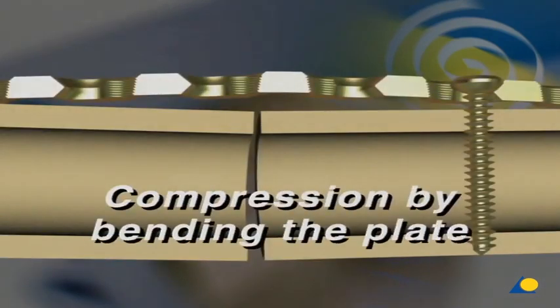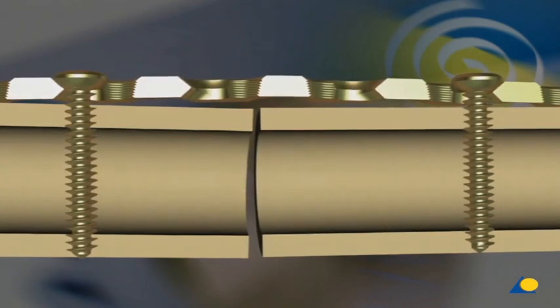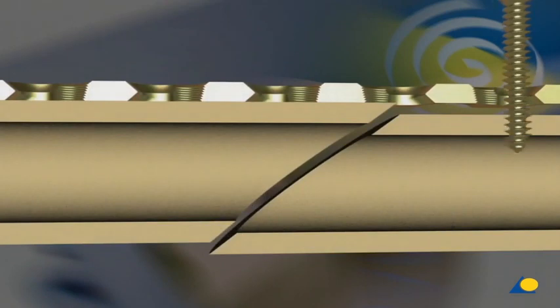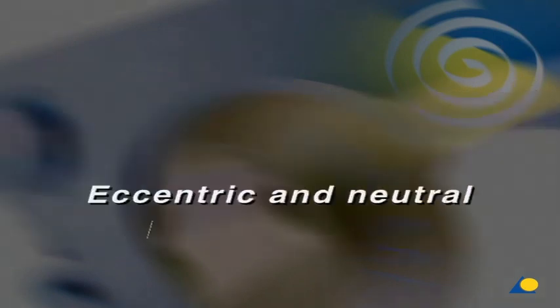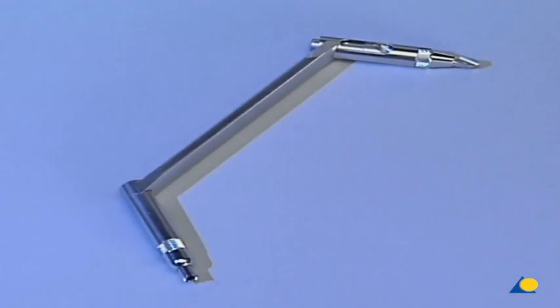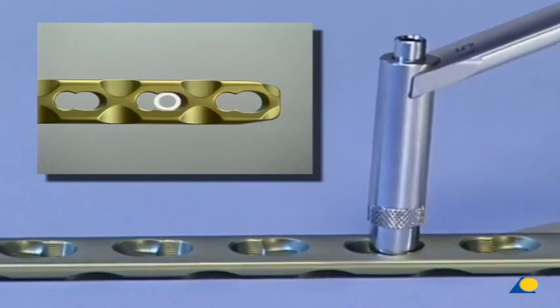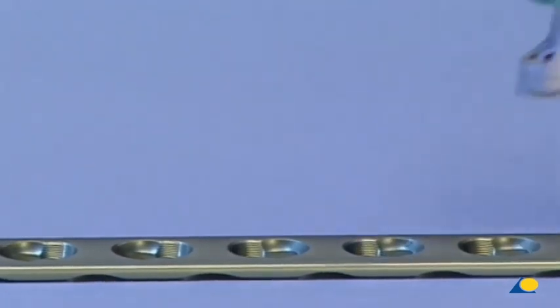Compression by bending the plate: bending the plate at the level of the transverse fracture enhances axial compression. Compression by using a plate lag screw: in an oblique fracture, the use of an interfragmentary plate lag screw contributes significantly to stability. To perform eccentric and neutral pre-drilling for standard screws, the universal drill sleeve must be used. In eccentric pre-drilling, the universal drill sleeve is placed on the edge of the dynamic compression portion of the combination hole. Pressing the universal drill sleeve into the hole allows neutral pre-drilling. DCP and LCDCP universal drill sleeves are unsuitable for the LCP.